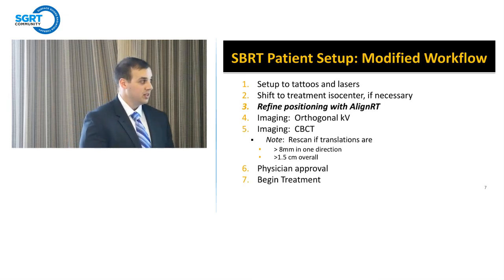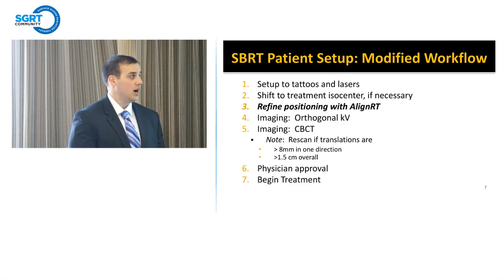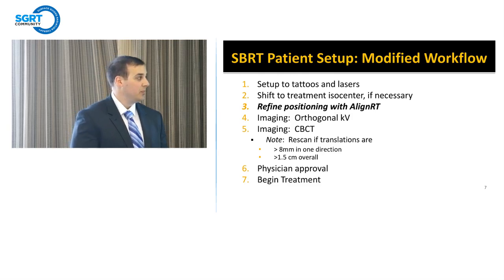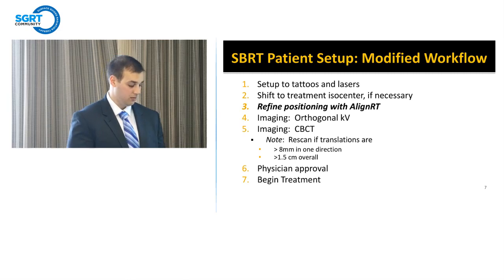And so this went on for several years, and then in 2016, when we actually started using our AlignRT clinically, we thought how to best not modify this procedure so that we're not breaking away from the current workflow, but how to enhance that workflow. And so we thought that between the shift to treatment isocenter as well as the 2D orthogonal KV imaging, we could perform refinements in the position with AlignRT. And so we are looking at, in some current ongoing studies and then some future studies, refining these first few steps to essentially be surface imaging and then moving into our 2D KV imaging, as well as our volumetric CBCT.